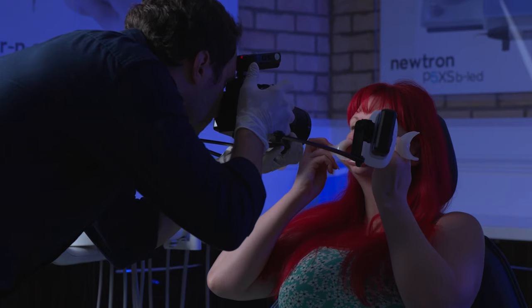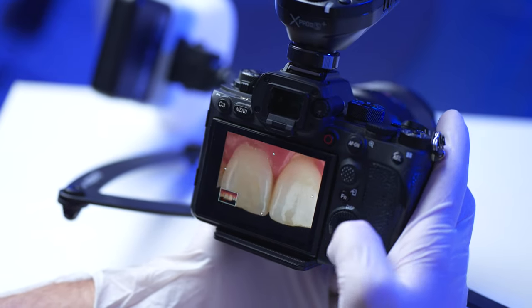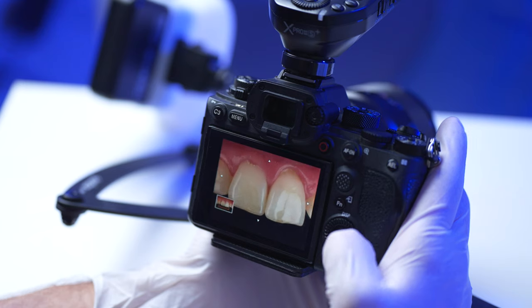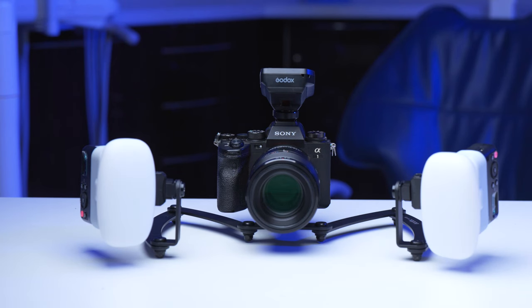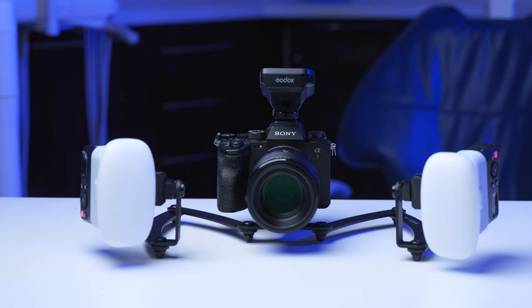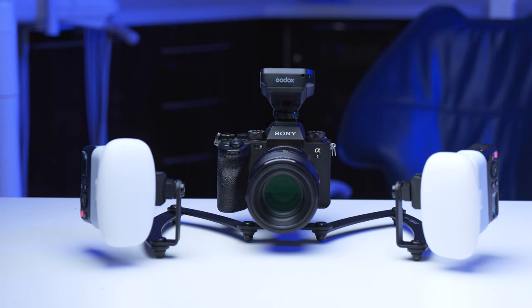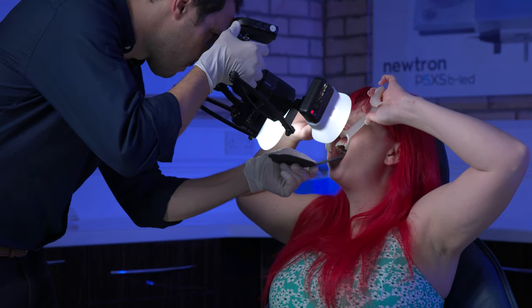The main difference is that a twin flash allows control over light angle and the ability to add diffusion such as soft boxes, but to do so it requires a bracket. Godox has now produced an MF12 quick kit with a bracket and diffusion included, which is great for an all-in-one solution without purchasing things separately, and it's a much cheaper alternative that will have a big impact on the dental market.